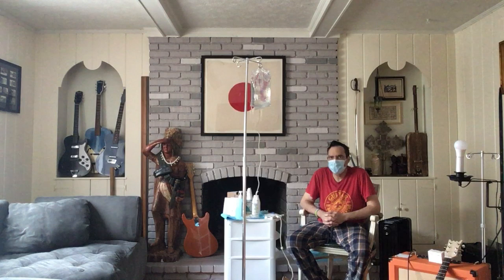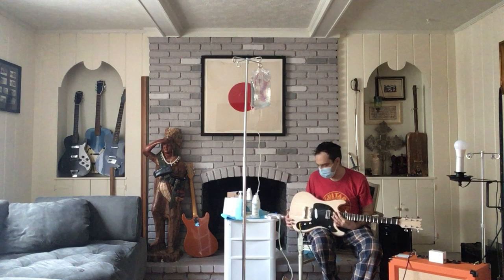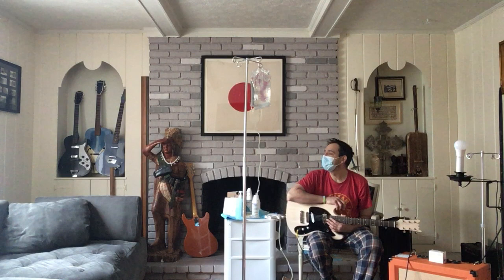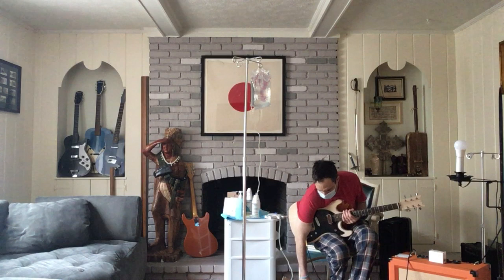I like to play guitar, as long as it's not obstructing any part of dialysis. I see a pick across the room, and I can't go get it because I have to stay within the vicinity of this line, this tether right here, as I drain. So I'm going to drain out. I'm draining pretty well. It looks fine. It's clear, as you can see. If you can read newspaper print through it, then it's good.